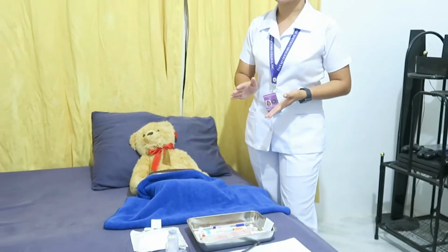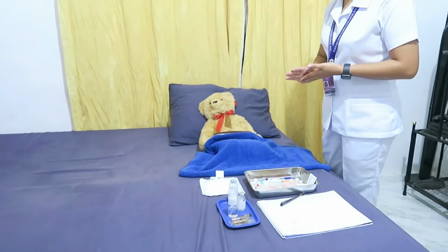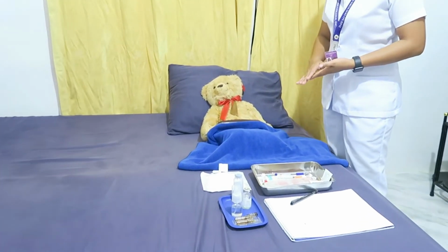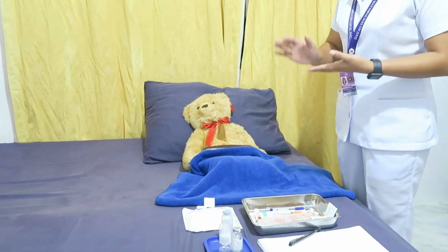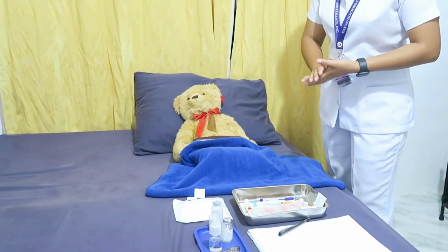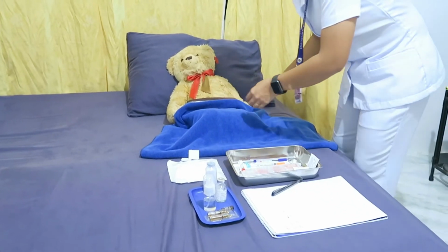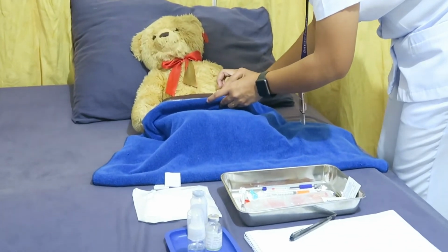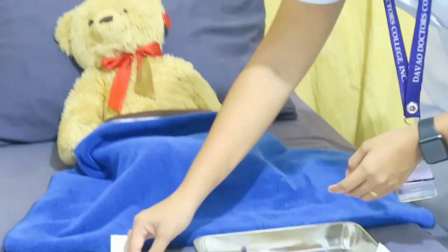After that, select and clean the site. The rationale for that is the friction aids in cleaning the skin. A clean area is contaminated when a soiled object is rubbed over its surface. Select a site free of tenderness, hardness, swelling, scarring, itching, burning, or localized inflammation. And after that, select a site that has not been used frequently. I will clean your abdomen and the site that we need to use. Okay, thank you, ma'am.